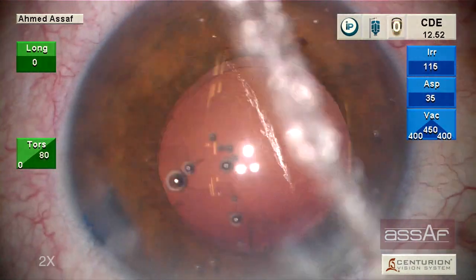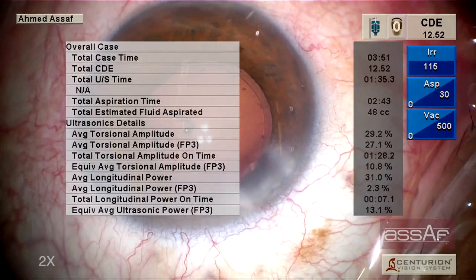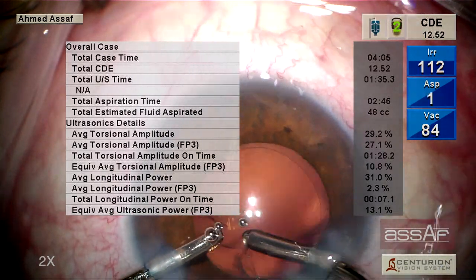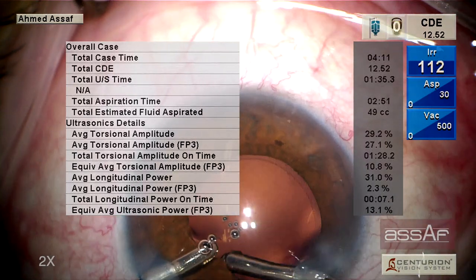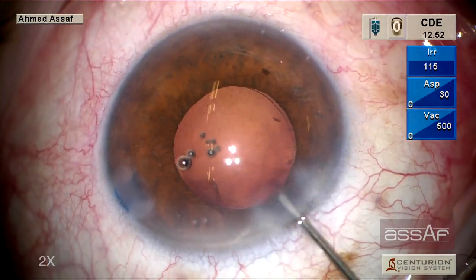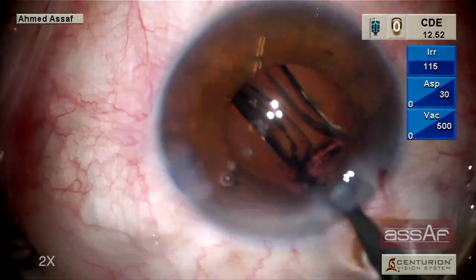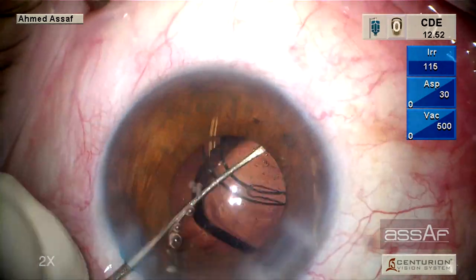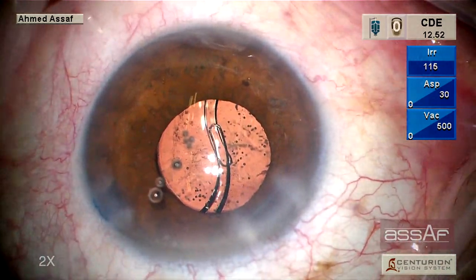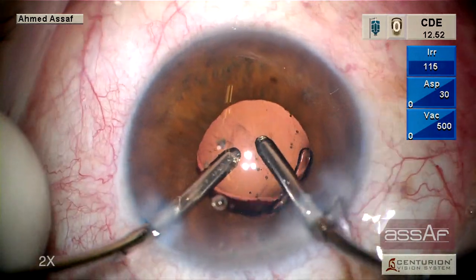As expected, we don't have too much cortex — just a few cortical fibers remaining. The equivalent ultrasound power in full position number three is about 13%. Now cortical cleanup with irrigation-aspiration follows, with just a few cortical fibers to address. We then inject cohesive OVD before implantation of the single-piece IOL, orienting it within the capsular bag, followed by irrigation-aspiration of the OVD from above and below the IOL.